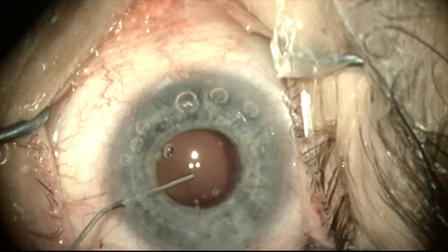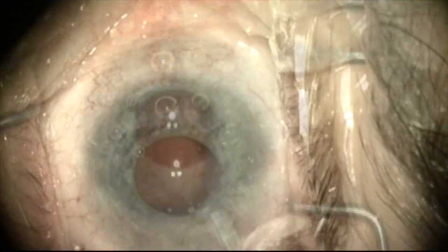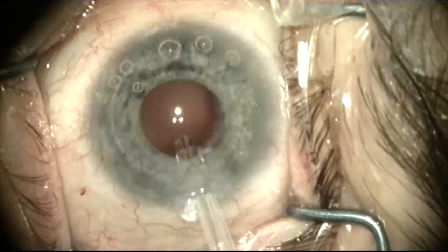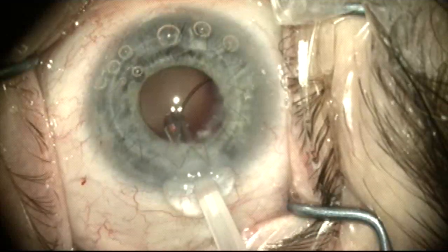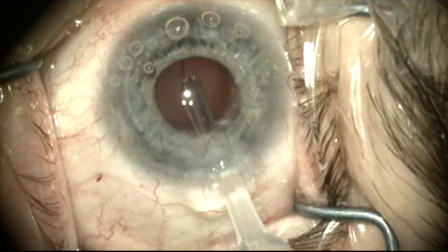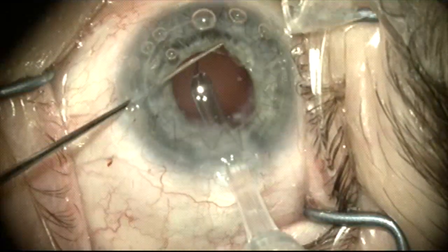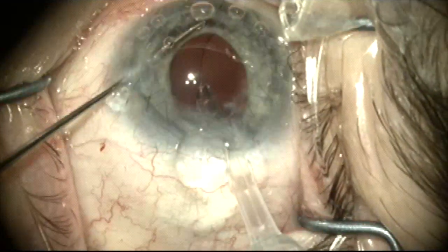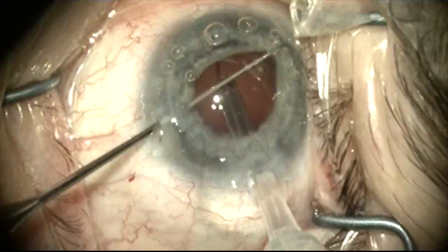The capsular bag is now filled with viscoelastic and we're going to place a capsule tension ring because again it is a very large eye and we want to provide support for the capsule bag. Here I'm starting to inject the capsule tension ring and I want to make sure that I'm in the right place in the capsule bag. So I'm going to stop, use a Kuglen hook, and retract the iris so I can better see the anterior capsule rim.